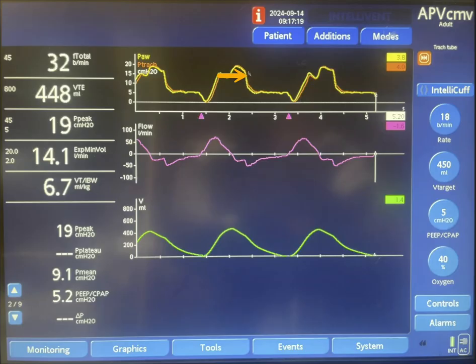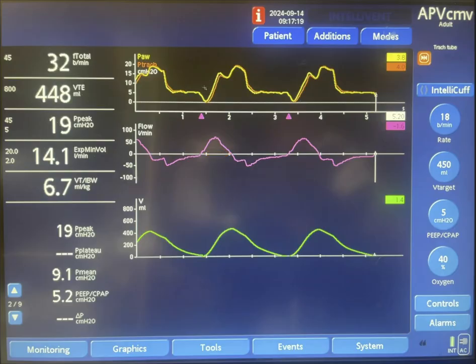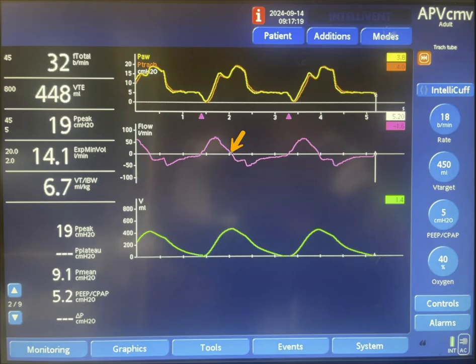The machine cycles at this point — meaning going from inspiration to expiration. The inspiratory time of the machine is set longer than the inspiratory time of the patient. So what we have in this case is delayed cycling, meaning the machine's cycling time is longer than the patient's cycling time. The patient exhales at this point, but the machine goes into expiration at this later point.